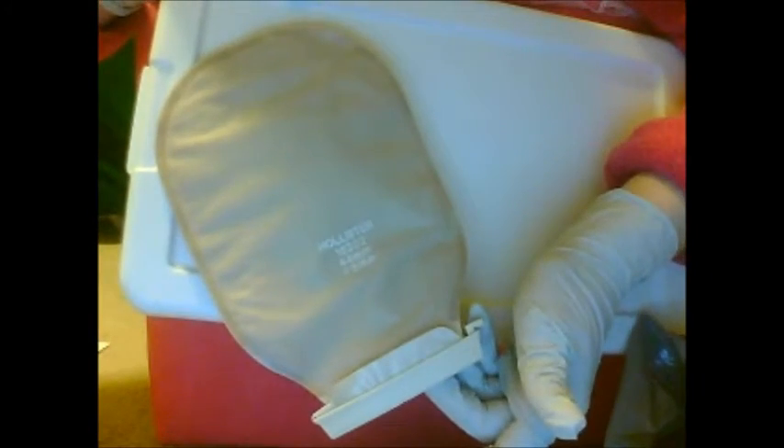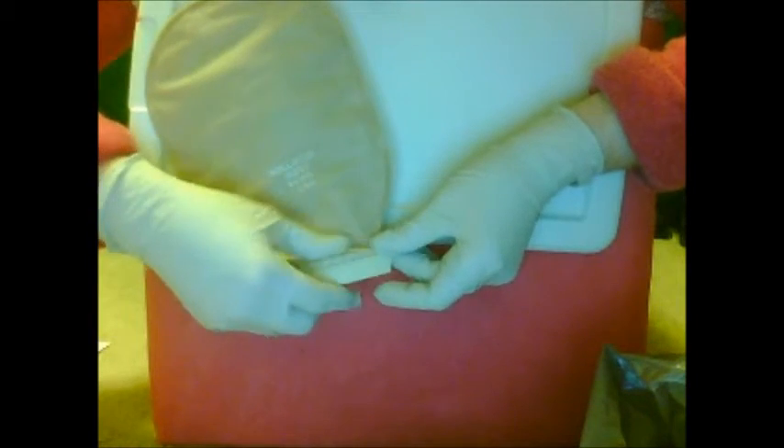I'm showing you how to empty this ostomy pouch. So you take the clip, hold it with both hands — you're sitting down — and you pull the clip open and just let that drop, and you can help it by doing this.